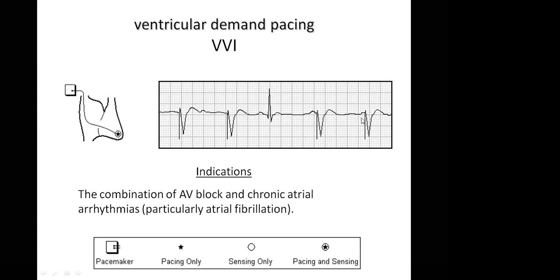It can also mimic something that looks like a complete heart block because there'll be AV dissociation, because the ventricle is not tracking the atrium. I just needed us to get this image as well so that when we are looking at the ECG, we're able to know what is happening. That's why I'm not mixing the EP class with the pacemaker class.